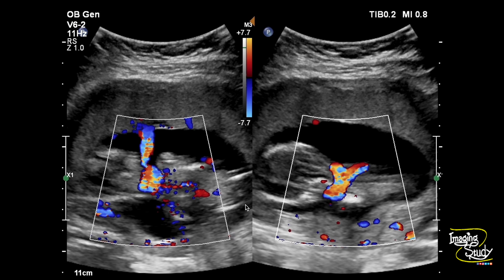We can also confirm it using 3D ultrasound, but it's a very small-sized fetus so using 3D may not give you a very good picture like it does in the third trimester. But let's see what we found on 3D ultrasound.